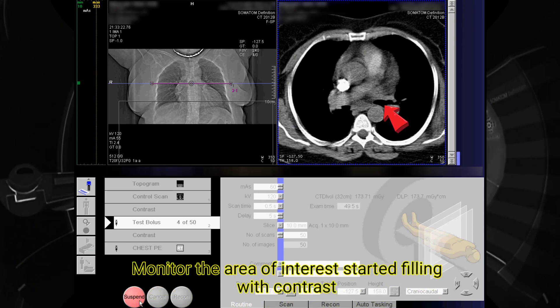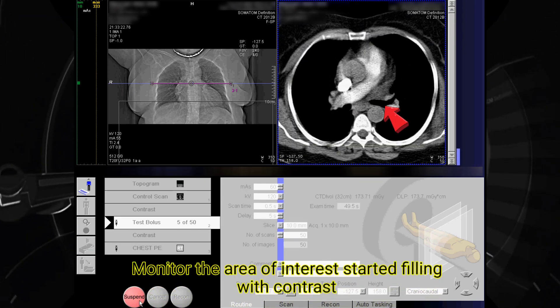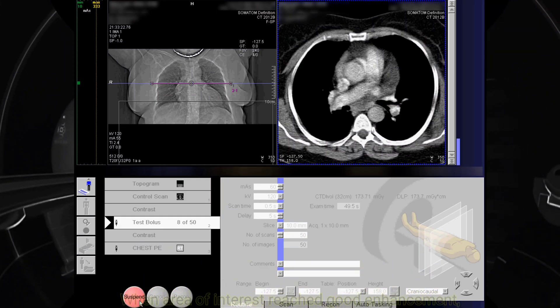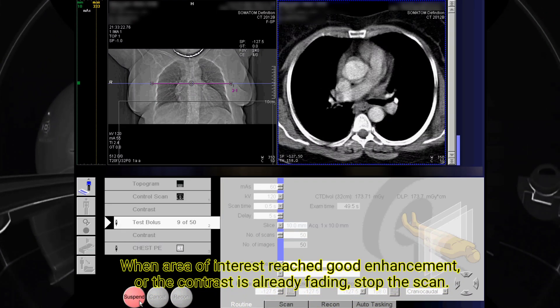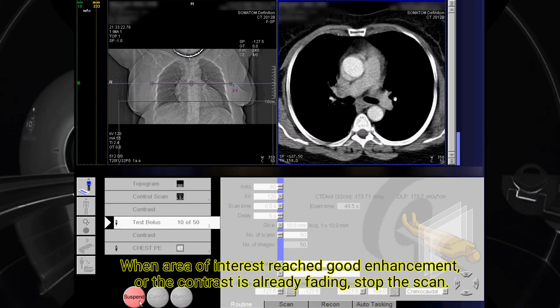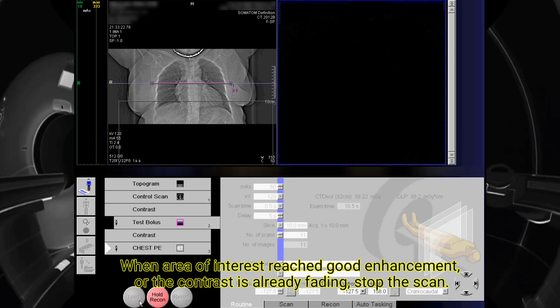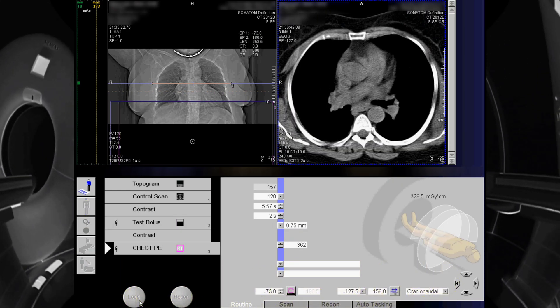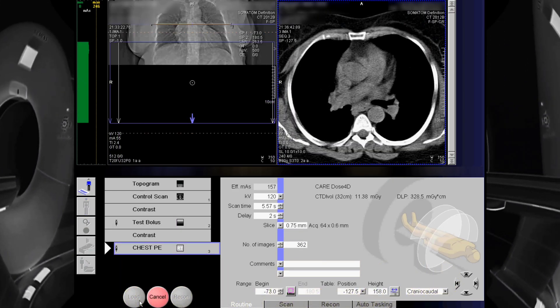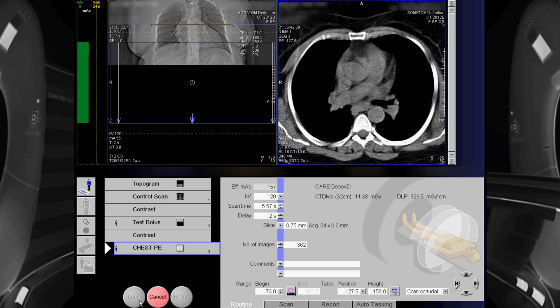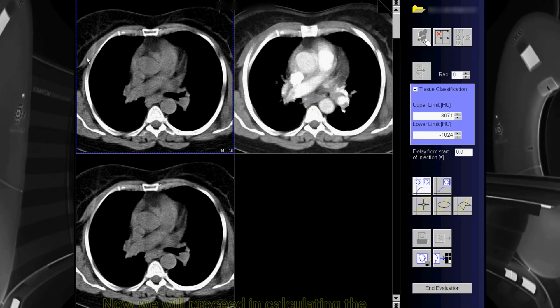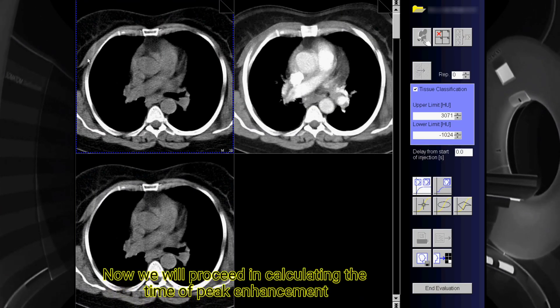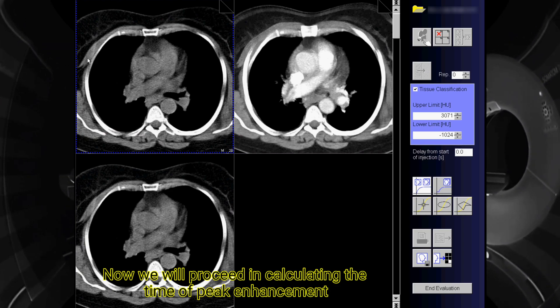Monitor the area of interest as it starts filling with contrast. When the area of interest reaches good enhancement, or the contrast is already fading, stop the scan. Now we will proceed in calculating the time of peak enhancement.